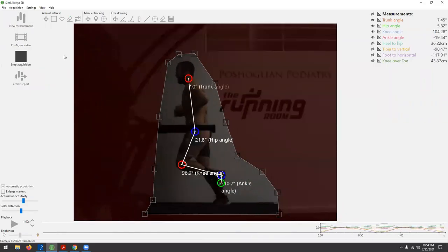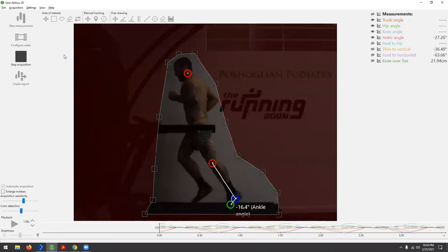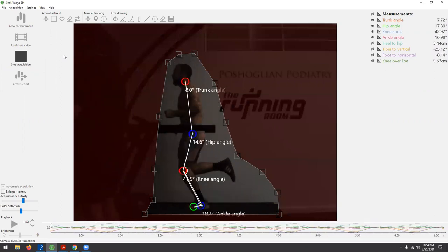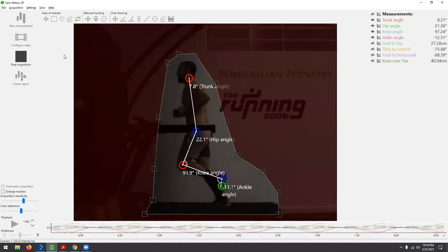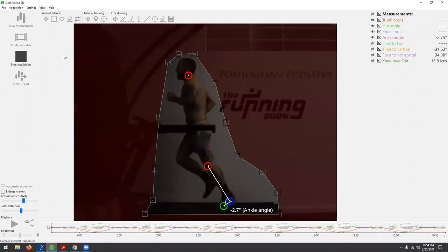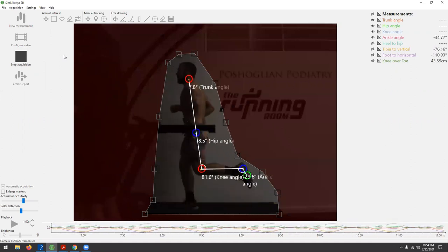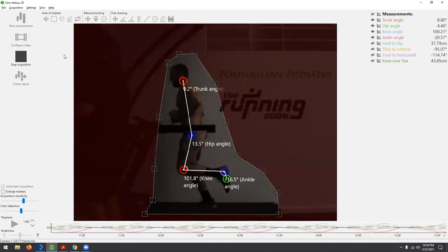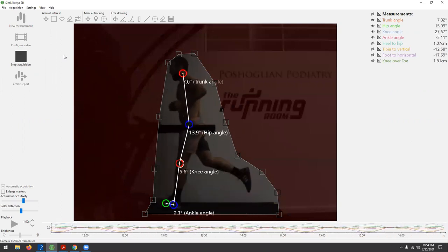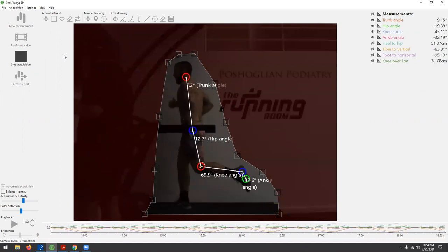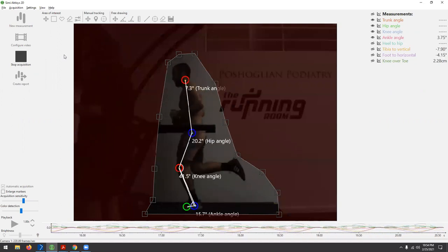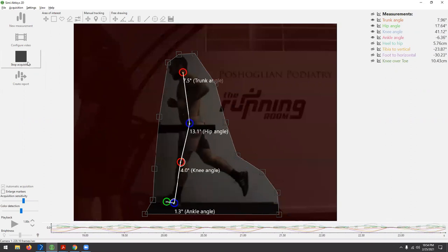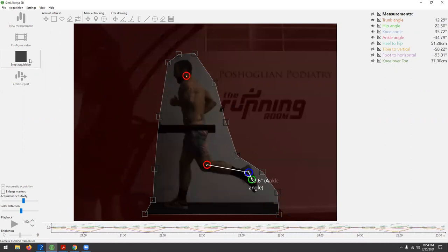As I push capture and start acquisition, you can see the camera is now tracking those joint angles in real time. This is really nice for gait retraining — we can set a sound cue if someone is overstriding or sinking down too far. For now we're just having a look at how Mel looks in the sagittal plane.